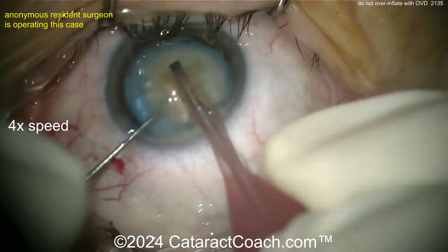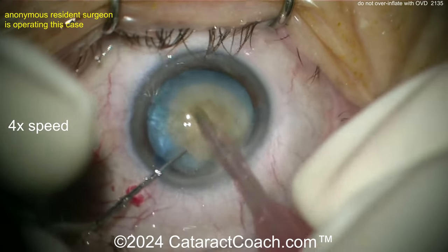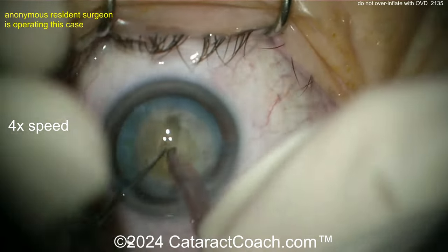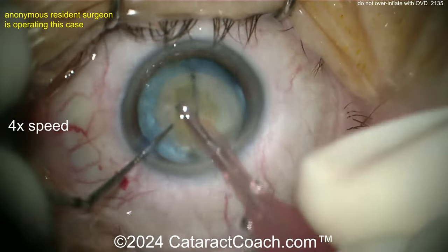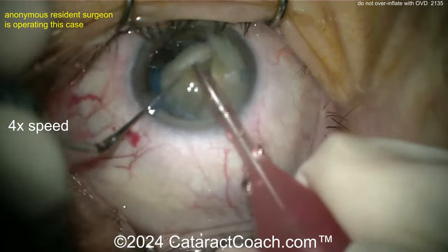Let's see the technique — we've sped the video up. Groove down the middle, maybe a stop and chop. Reasonable amount of density to that nucleus too. Now you've got to be careful because think about where is the rip in the anterior lens capsule — it's sub-incisional. So if you now put force on that capsule, like when you crack the nucleus into two halves, if you put too much force, you can cause that tear to rip around to the equator and then posterior capsule.